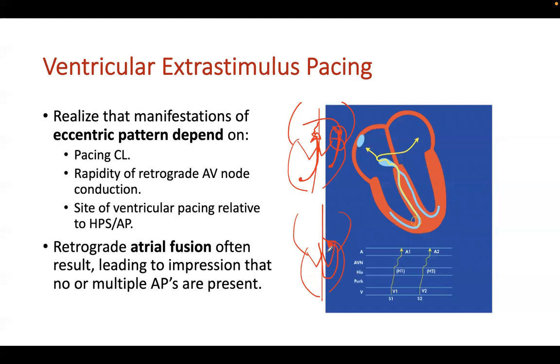Okay, so very often you will get retrograde atrial fusion, meaning you're going up the AV node and up an accessory pathway, and hence your map would not be perfect. You're mapping two different pathways, and your atrial activation would be in between. Your best point would be a little bit in between these two sites. Okay, it will not be very perfect.